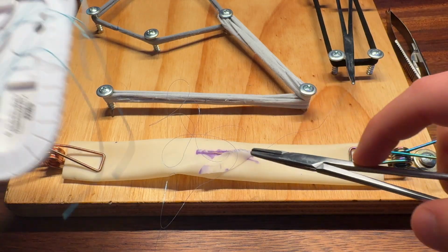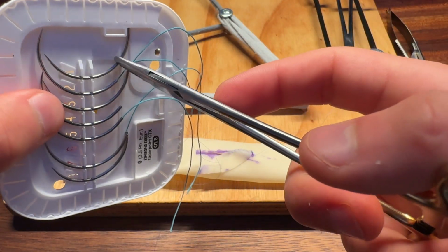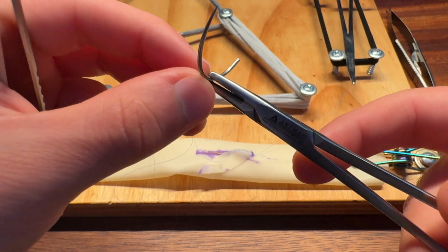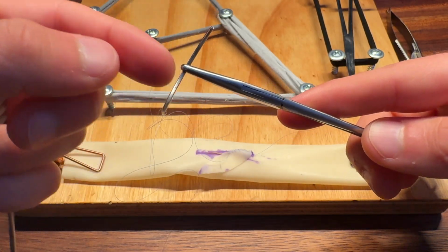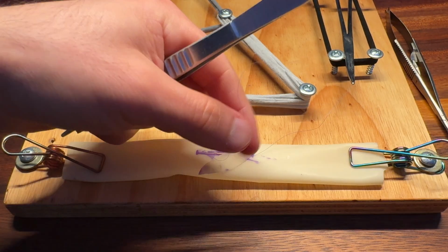Setting that aside, whenever it comes to suturing blood vessels together, you want something that doesn't have any edge to them. So you want something called a taper point needle, right? Essentially, there's no edge. Everything is nice and flat. It's circular, and it's not going to traumatize the tissue, especially something as delicate as blood vessels.